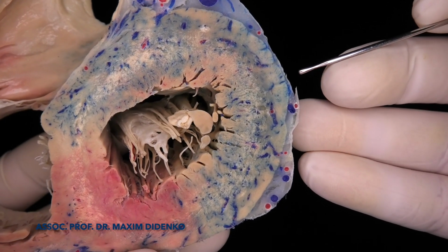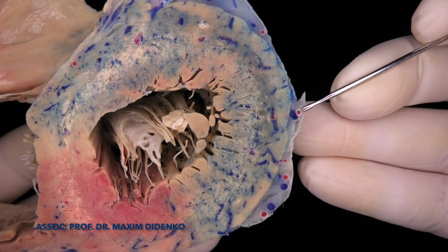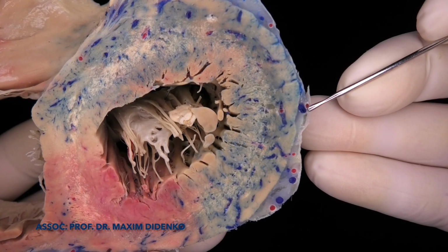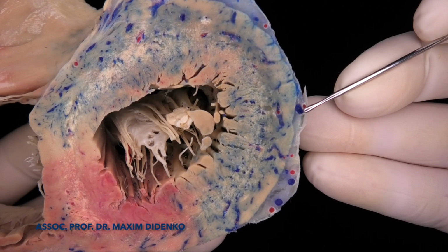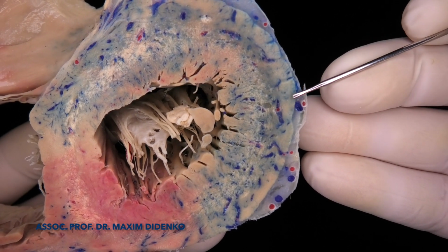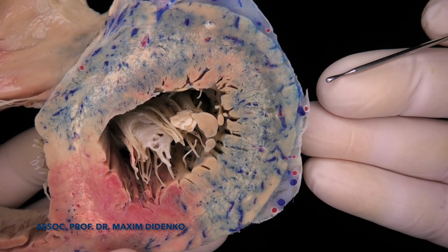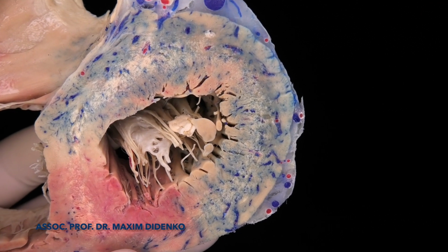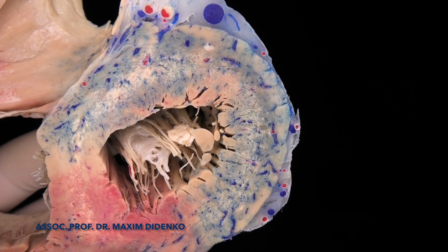But in this patient, you can see this lateral vein with a small diameter, but enough to implant the lead inside this vein, and it's really contacting the compact part of the myocardium, and can be used for cardiac resynchronization therapy.